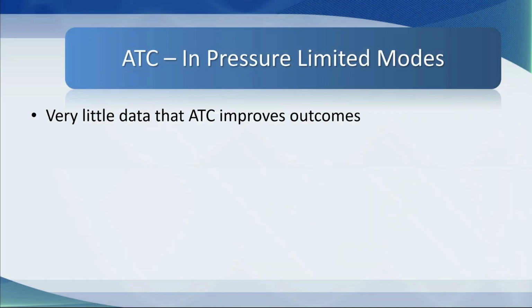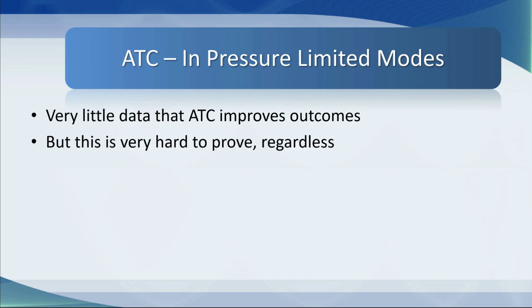Importantly, when we're using ATC in pressure limited modes, there are very few published papers that show that ATC improves outcomes. But you know what? This stuff is really hard to prove because everybody has different ways of managing their patient. Every patient is different. And so saying that there's no evidence to support it really kind of misses the point. It is a tool in your armory that you can choose to use, and it may make your patient more comfortable, particularly when they're struggling at low levels of vent support.